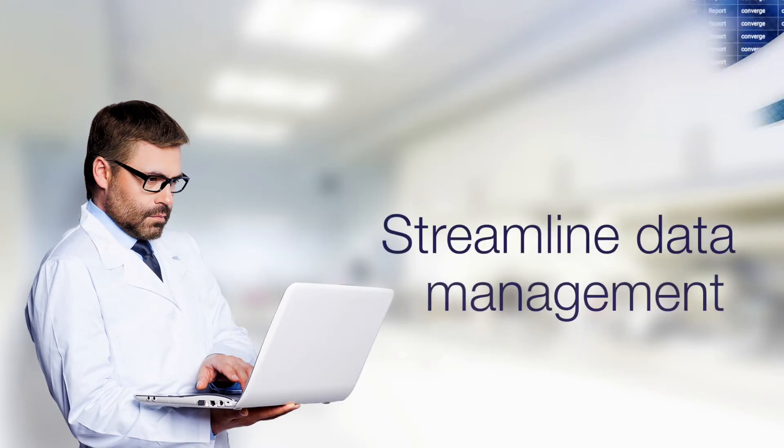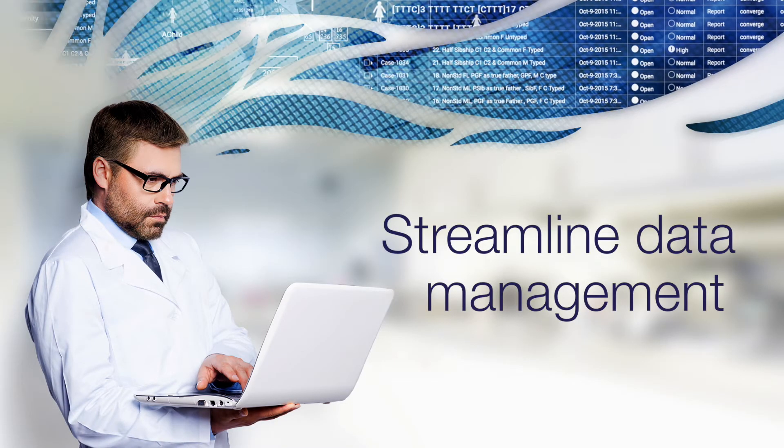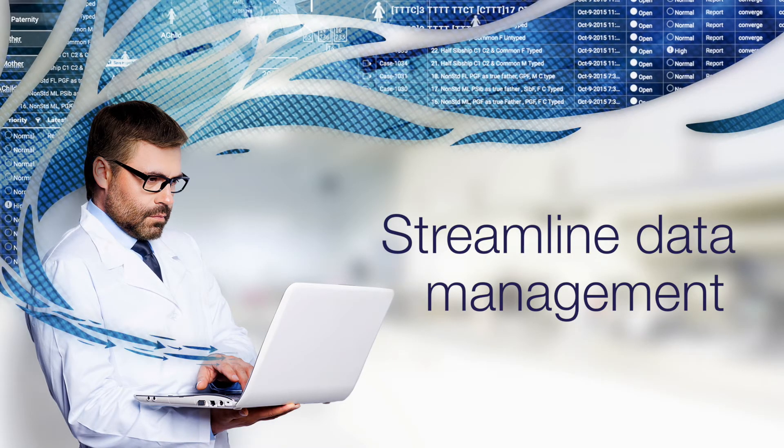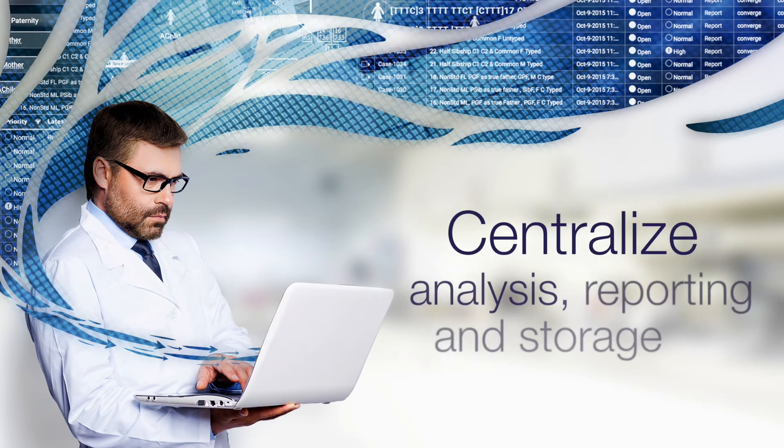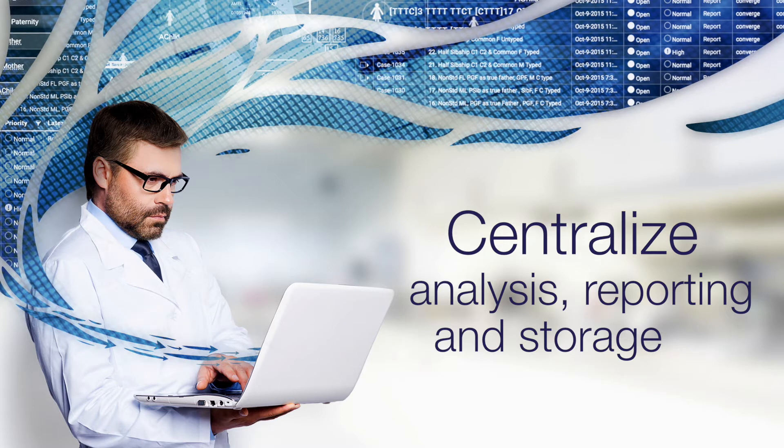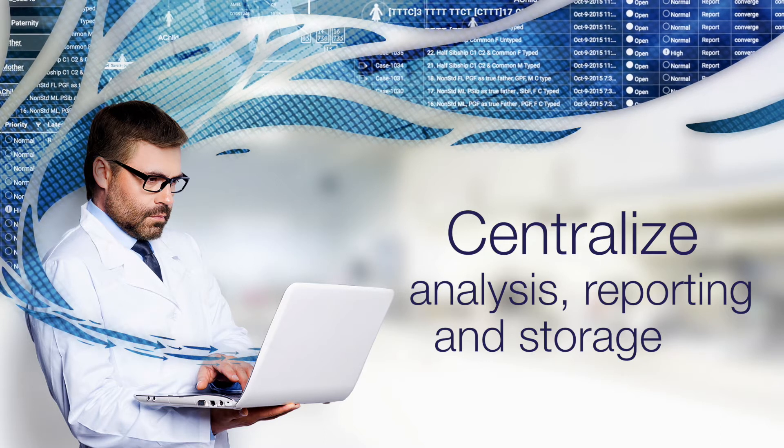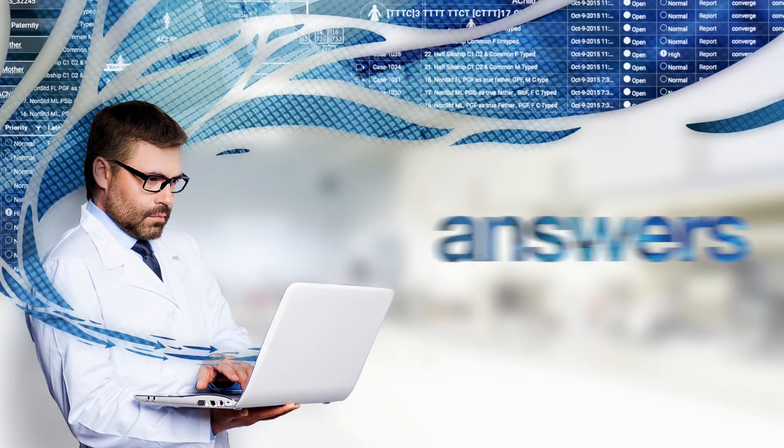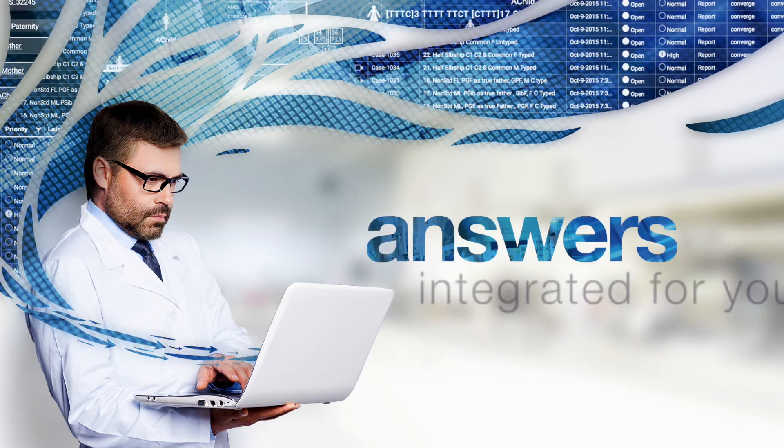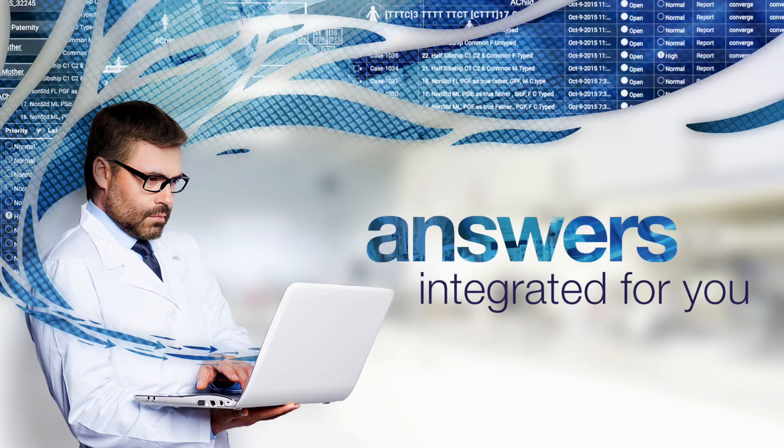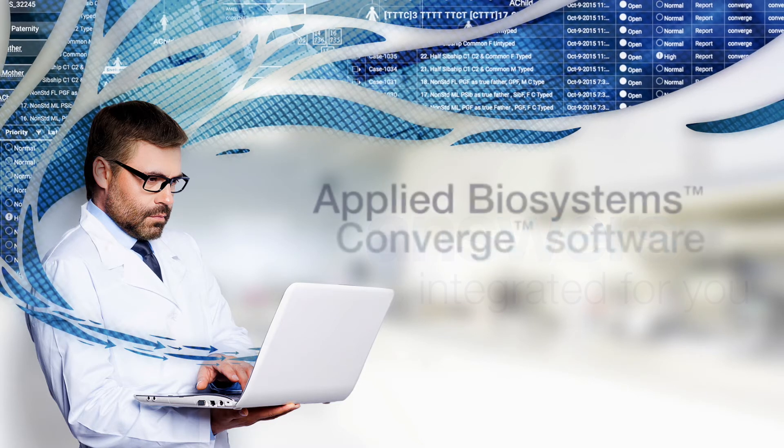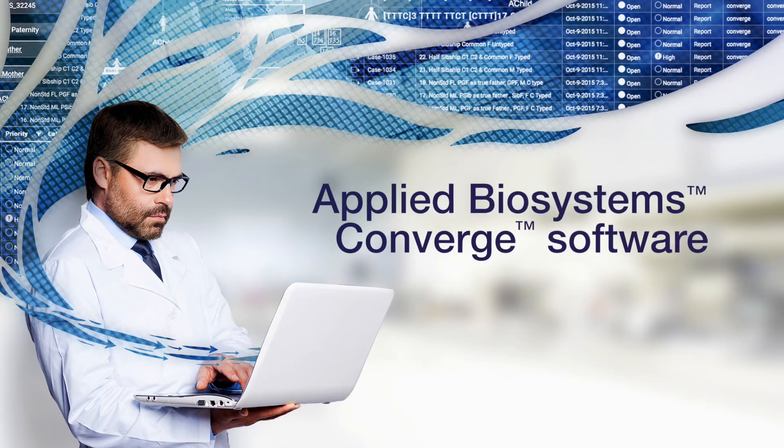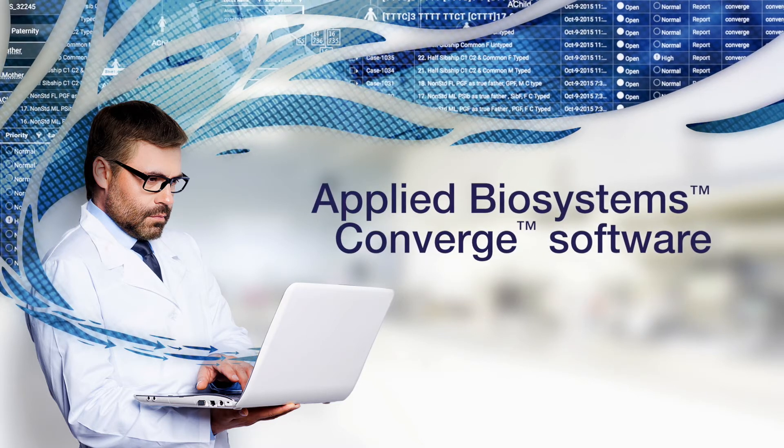Streamline data management with a powerful, centralized solution for analysis, reporting, and storage. Get answers integrated for you only from Applied Biosystems' Converge software.